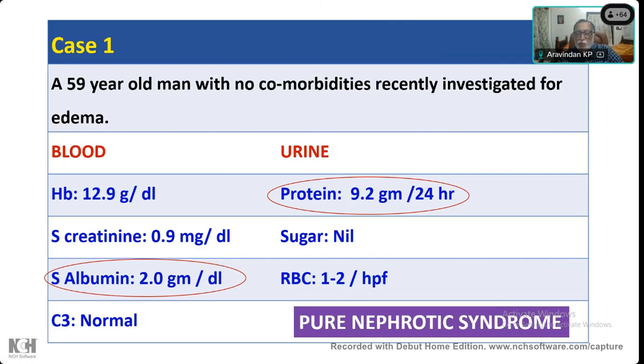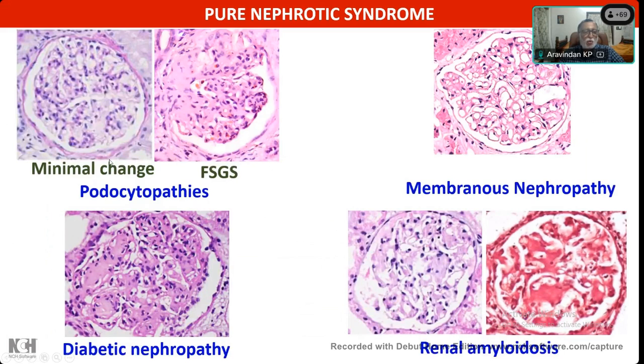So there's a lot of overlap, but usually what will present as pure nephrotic syndrome? Nephrotic syndrome can start with minimal change disease. Okay, minimal change, very good. Membranous nephropathy can present with nephrotic syndrome. Or focal segmental glomerulosclerosis. So minimal change and focal segmental sclerosis together, they're called the podocytopathies, isn't it? Yes. So podocytopathies would be one of your possibilities.